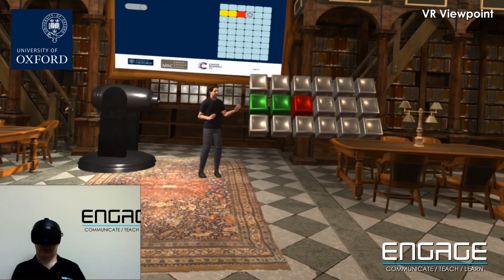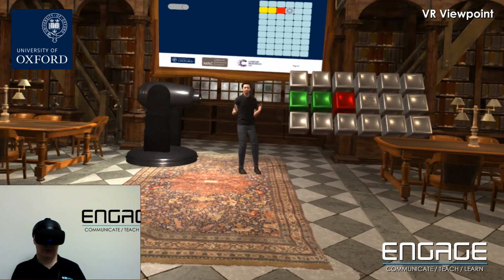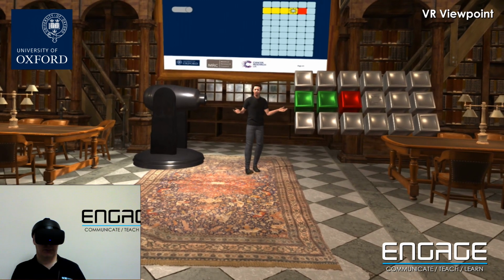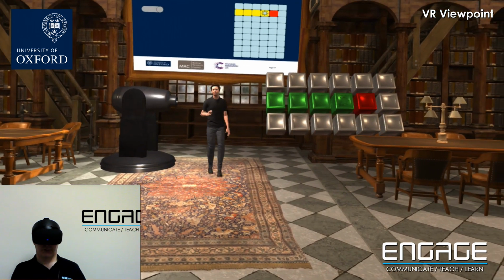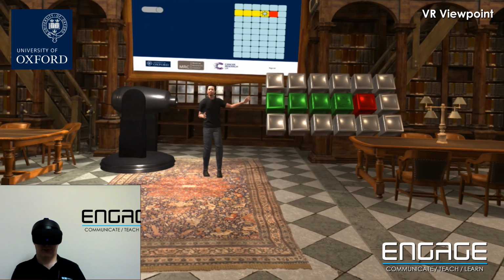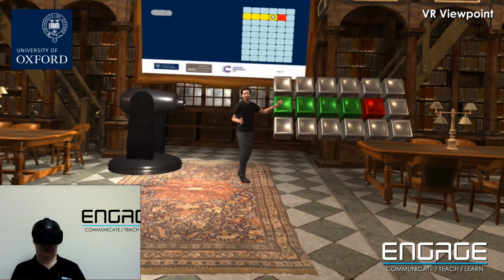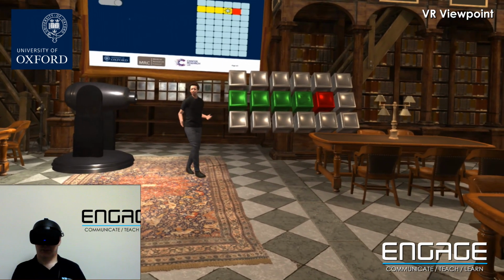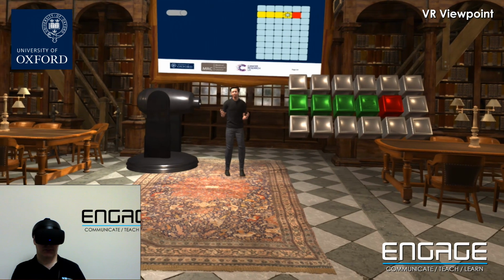But if the beam stops short, then the tumor will be spared any radiation at all, and I'll do some damage to healthy tissue. If the beam goes too far, I'm going to spare the tumor the worst impact, which I don't want to do, and cause some damage to somewhere where I don't want to damage. So I need to get it right.